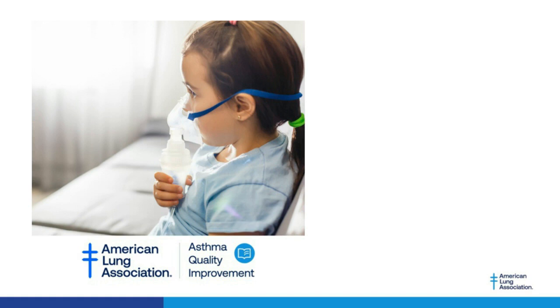Thank you, Ed. I have two similar questions coming in about whether it is safe to conduct spirometry on a COVID survivor for research purposes, and if yes, whether there are any specific guidelines. We have 3 different guidelines about how long to wait. The European Respiratory Society says wait 30 days after the patient has COVID. The American Thoracic Society says 10 days after symptom-free. Our infection prevention decided on 21 days for all procedures after COVID infection, standard across the board for all different types of procedures.